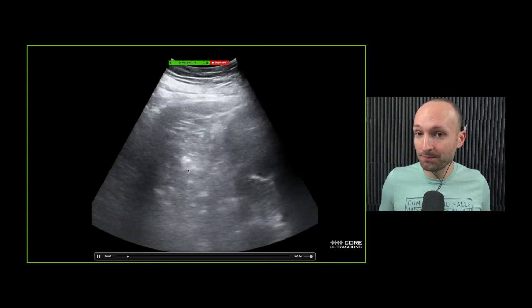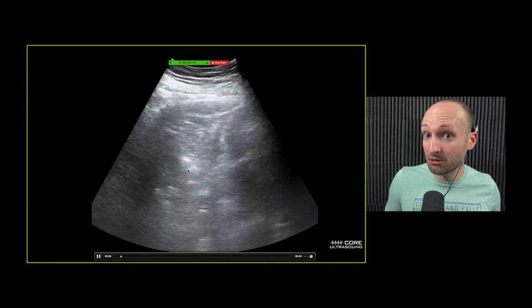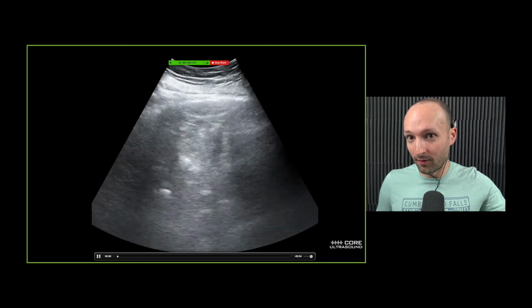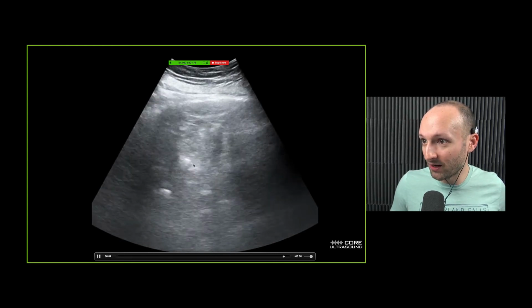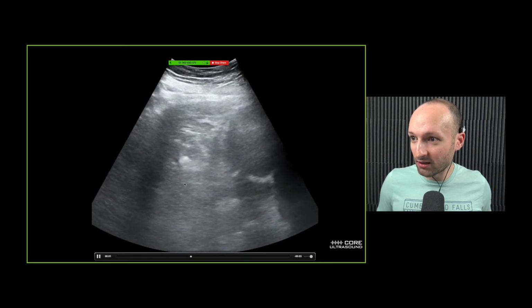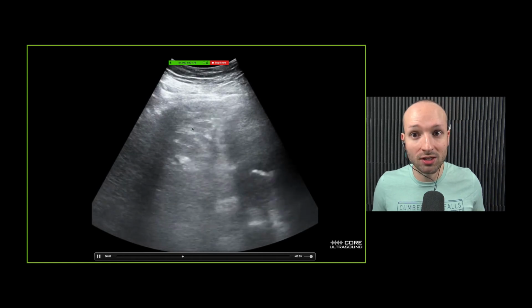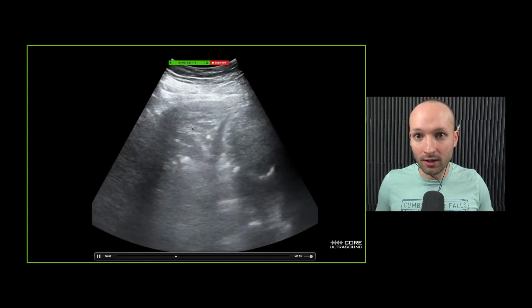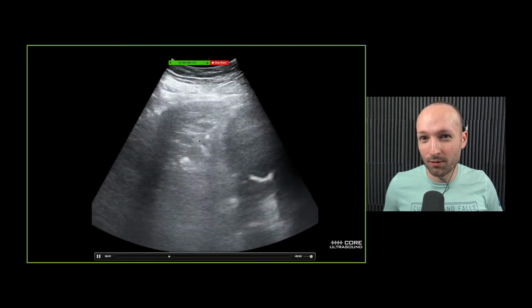see through air, right? This is a left retrocardiac pneumonia that I saw that was initially missed by the X-ray. I know that it's left even if I wasn't the guy that did this, because I see the heart and I see this is right behind the heart. So all of this white stuff here, these are air bronchograms. If you see this in a patient in whom you have a pretest suspicion of a pneumonia, this essentially diagnoses your pneumonia. And these are called static air bronchograms.